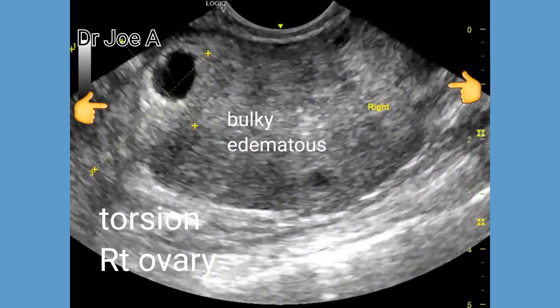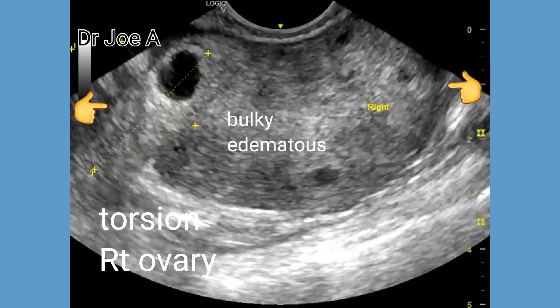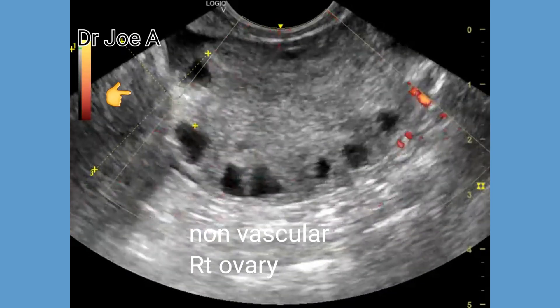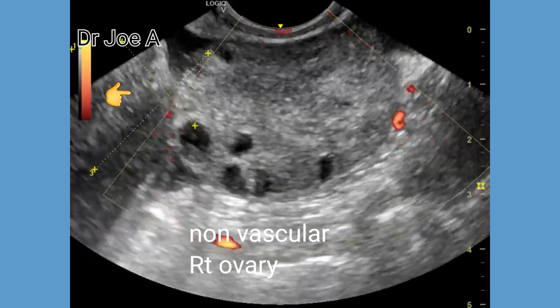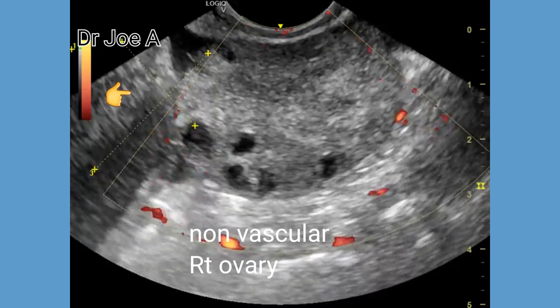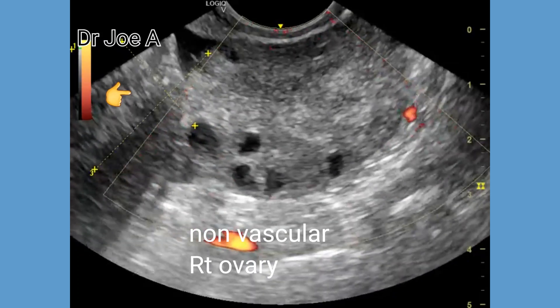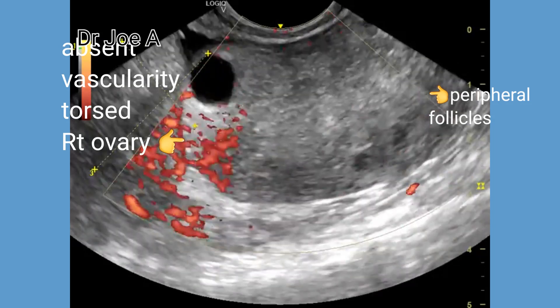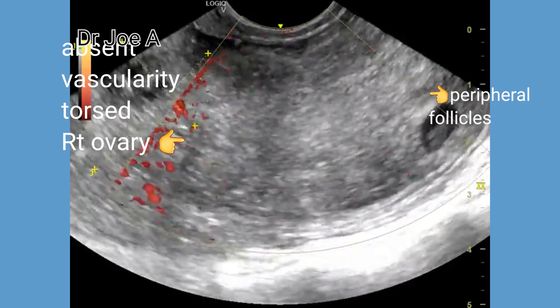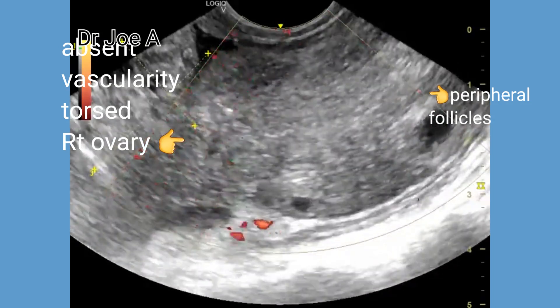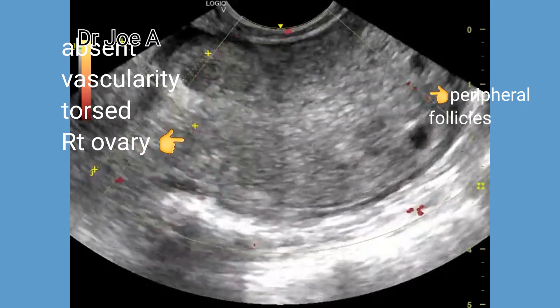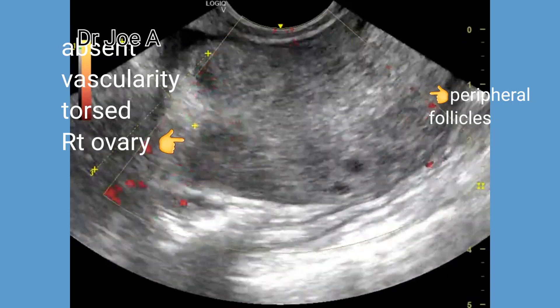All these findings suggest a diagnosis of torsion of the right ovary. Color and power Doppler ultrasound also confirmed absolute lack of vascularity in the right ovary, further confirming torsion with absence of vascularity.